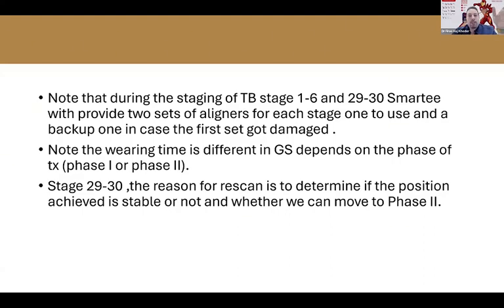Wearing time is different, depending on the phases of the treatment, phase 1 and phase 2. As we said, in phase 1 we have 10 days, and in phase 2 we have 7 days. At stages 29 to 30, we need to rescan so we can determine if the position achieved is stable or not, and we can move to phase 2.